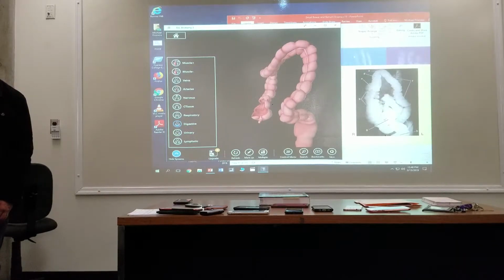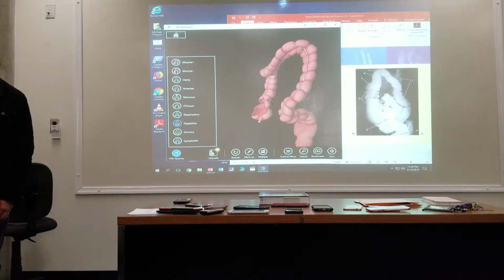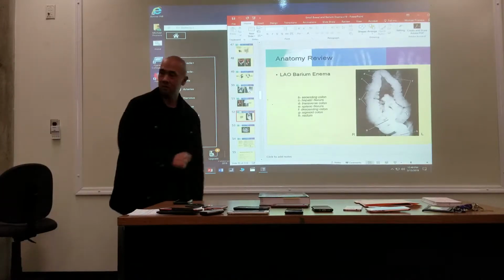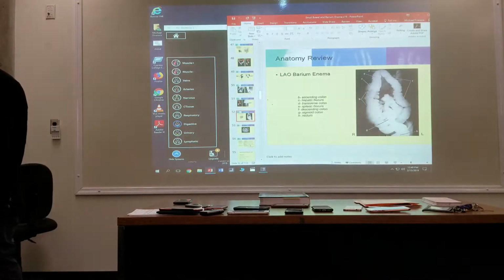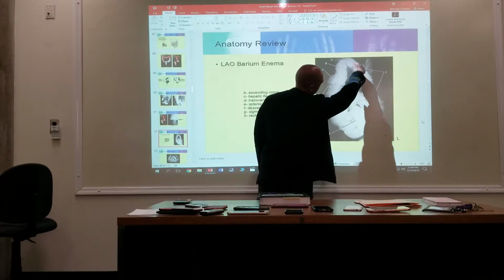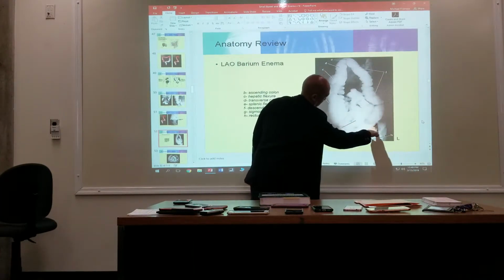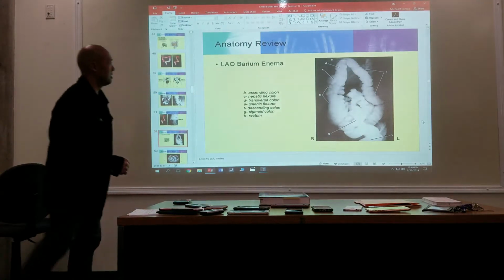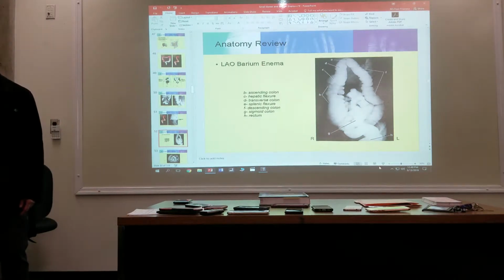Okay. So on the radiograph, all inside this big loop, right? Is it like a small bowel that also has a contrast? No, this is all large bowel. That's all large? Yeah, so his rectal sigmoid area comes up like this. It's a huge giant S, so here, let me just blow this up. So his sigmoid, so this is all descending, and then comes up like this. Sigmoid, oh.